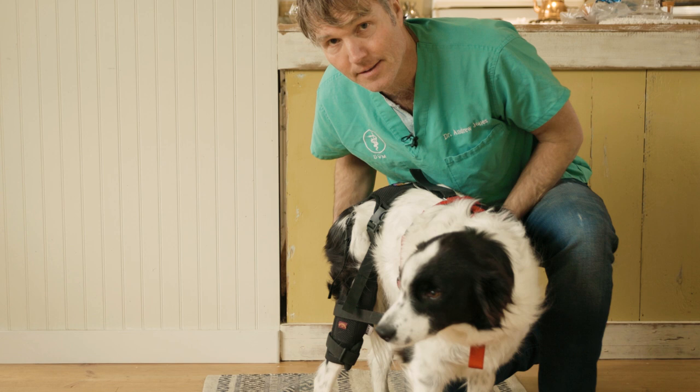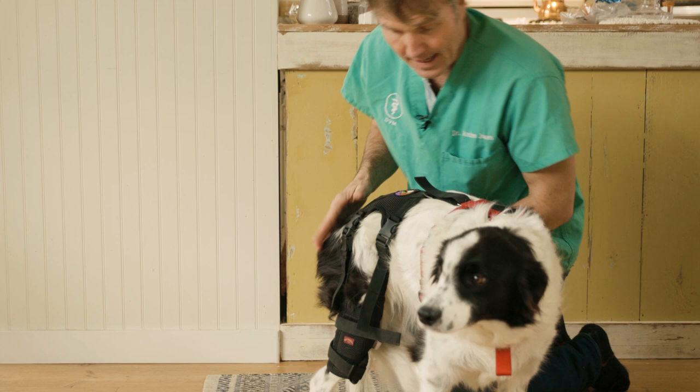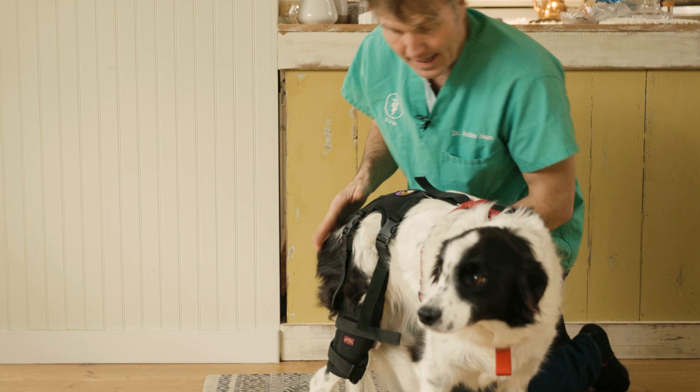He took her into the veterinarian. They worked her up and confirmed she's completely torn her ACL. She's a good candidate for surgery, but you're going to be looking at $5,000 plus. So we're trying some conservative treatments, including a dog brace.